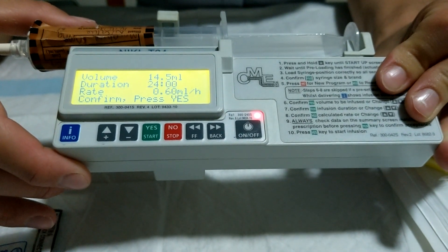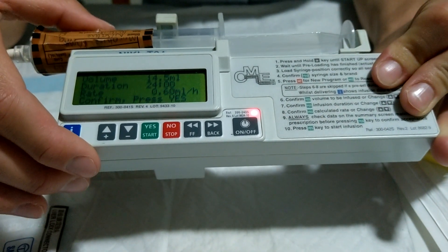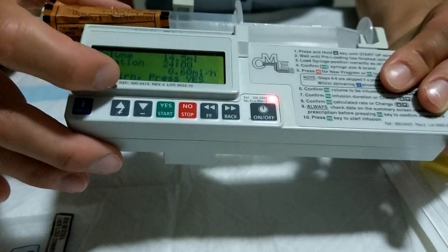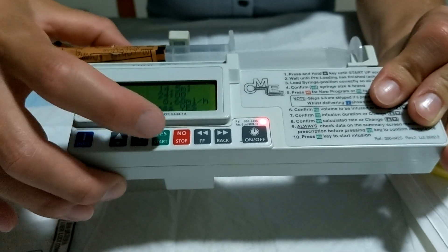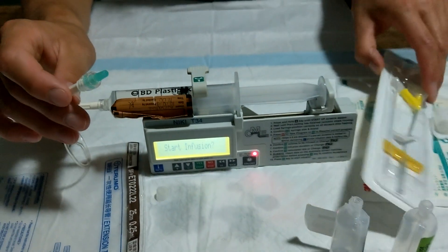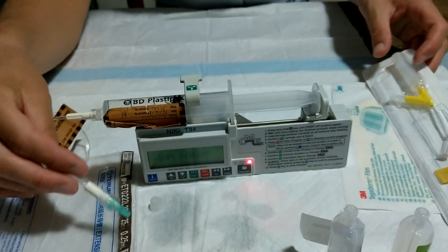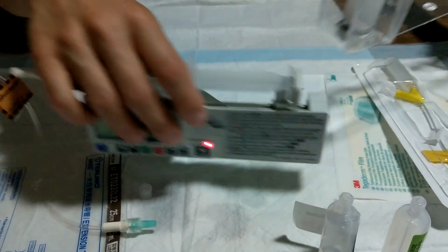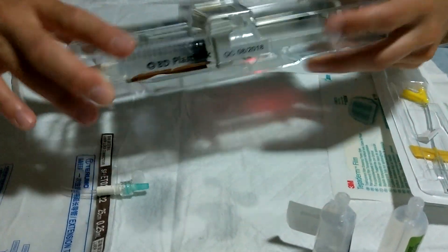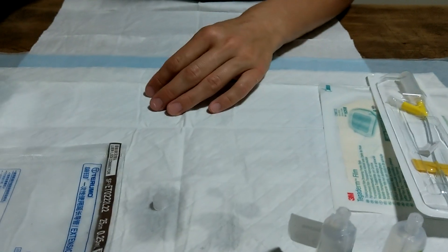At that point it will automatically detect the volume in the syringe and the duration — these are all set to 24 hours — and then it calculates the rate per hour over that time. In this case it's 0.60 mls per hour. You don't need to change that unless you need to reduce the duration, so we usually just press yes to accept. Then you're ready to start the infusion — connect this end to the end of the subcutaneous line already in the patient. Once you've done that, lock the driver in its box, which just prevents any tampering. And the patient is all set up.